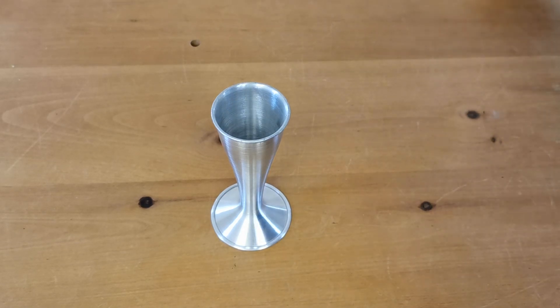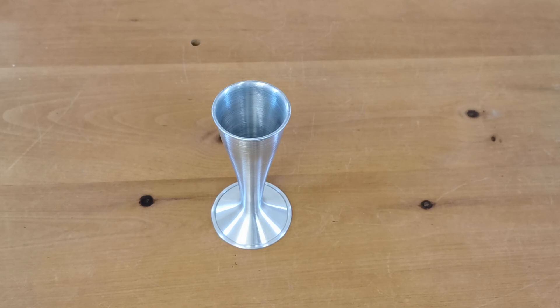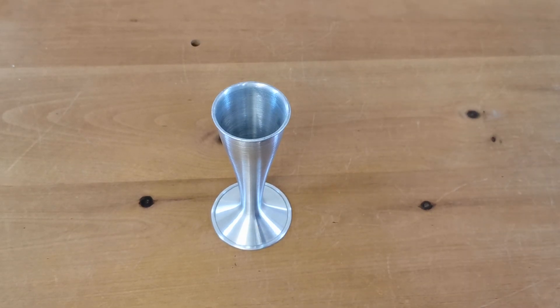They're available on the Valumed website now. We'll put a link off the website to the actual item as it appears. These are coming in at around the £7.50 mark — might be cheaper. There will be offers on these from time to time, so follow the link to check the actual current offer price on the Valumed website.